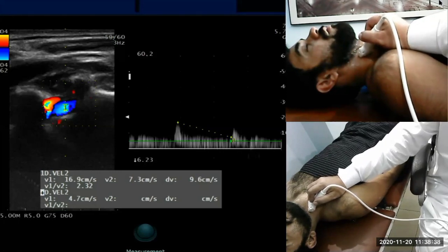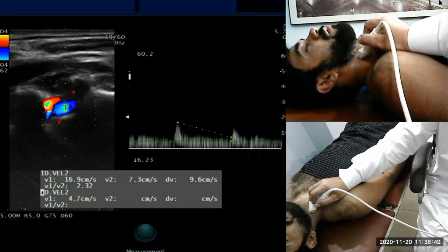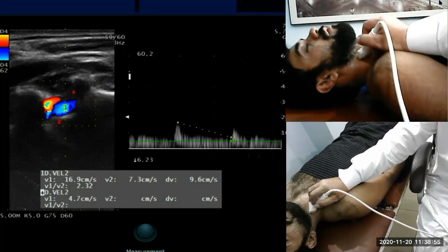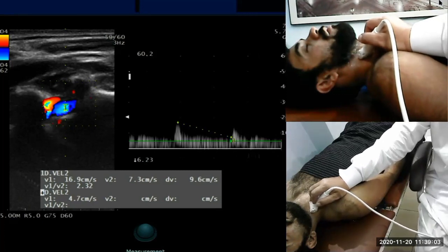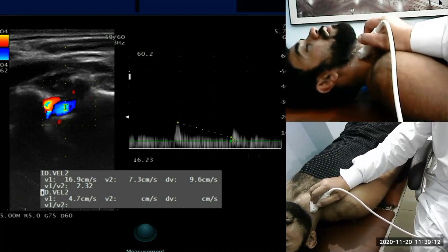And therefore, this should be the ratio. More flow should be there in the diastolic phase compared to the systolic peak, which is the other way when we consider non-vital organs like muscles and skin, like we see in external carotid artery. So therefore, we'll find the systolic diastolic ratio of vertebral artery similar to that of the internal carotid.